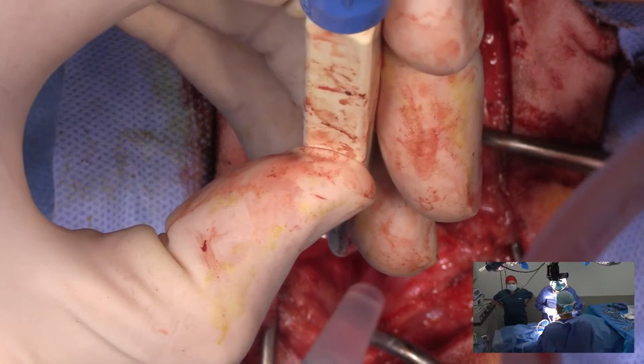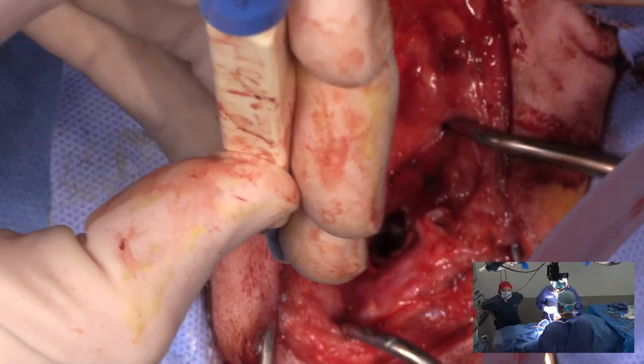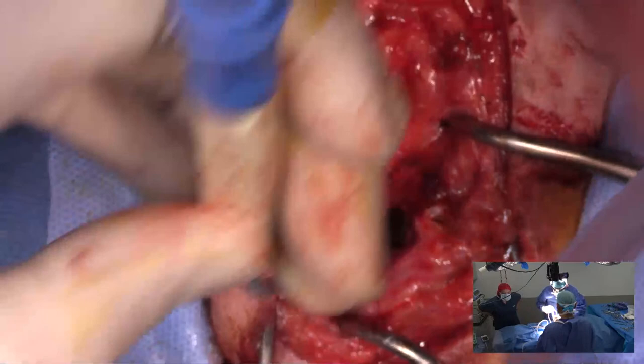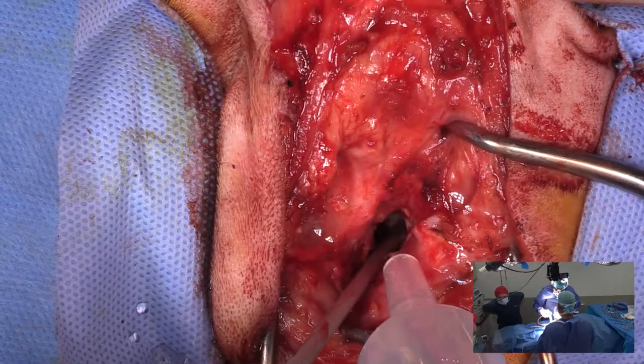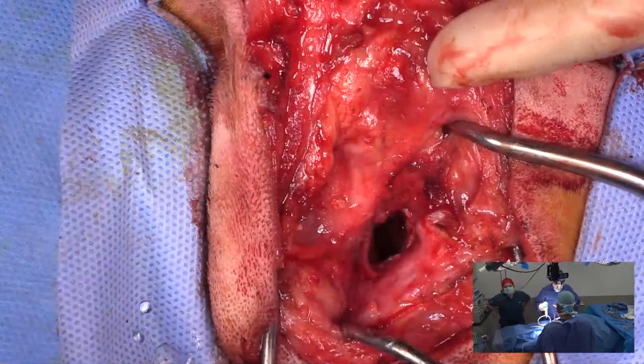Janine, can you guys see the inside of the bulla there, that white bone, when I use my loops down there? So where the suction is, can you see white? Yes. Yep, great. How about now? Okay, so I'm pretty happy with that.